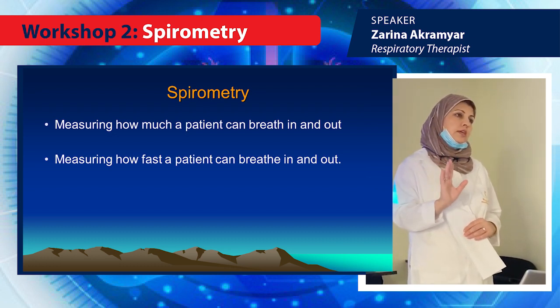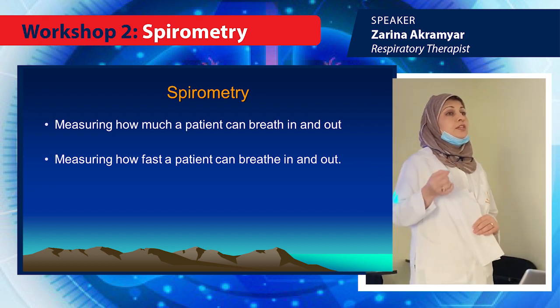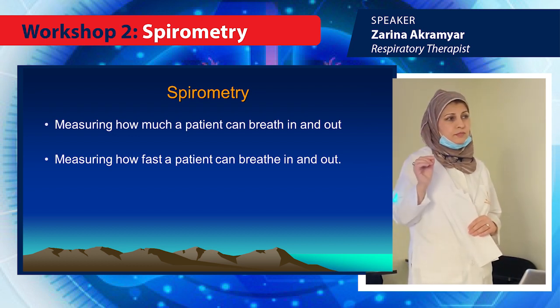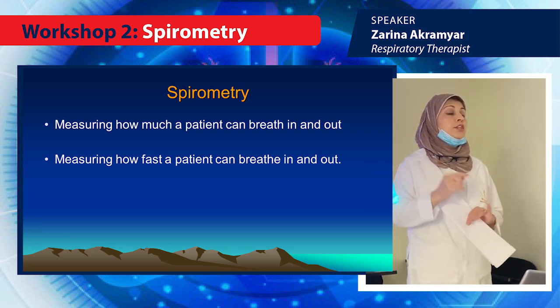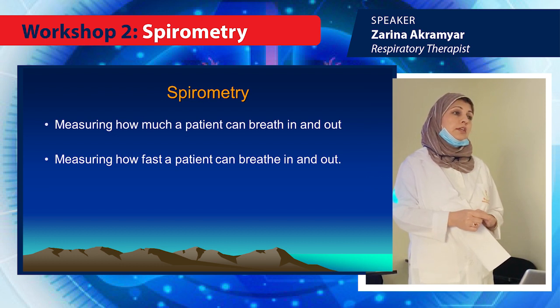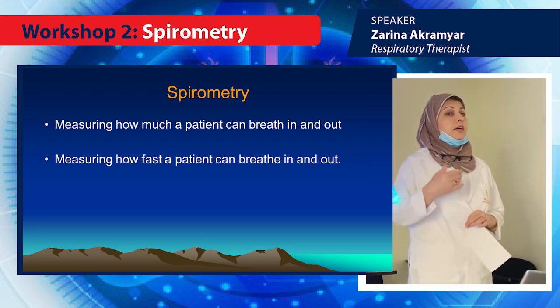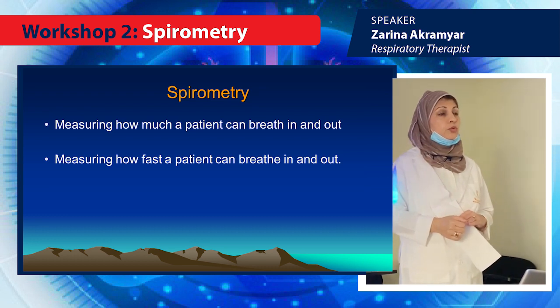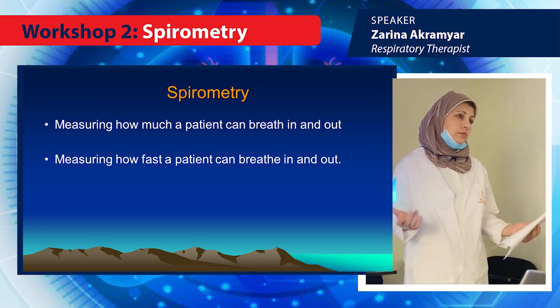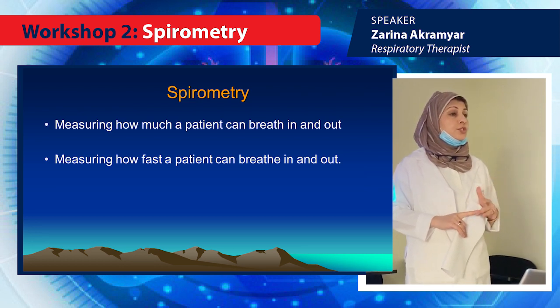But if you don't know, it's because it's an effort-dependent test. So we ask the patient to do his maximum effort. This is not easy, and this maximum effort is achieved by instructions and coaching. Instruction, we always tell the patient how to do it. With each maneuver, we explain and also we demonstrate. Because if we don't demonstrate, they don't know what to do. So instruction, demonstration, and coaching is important.